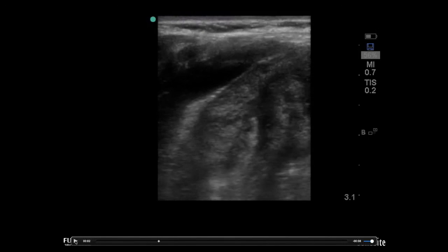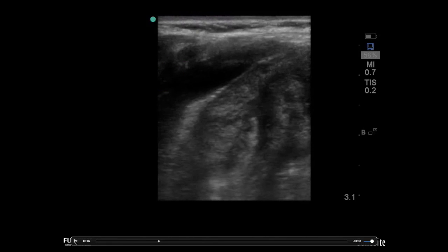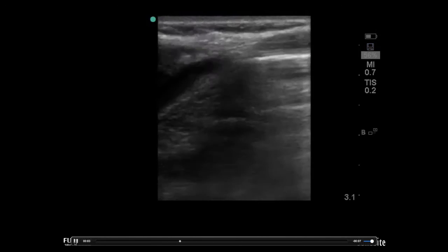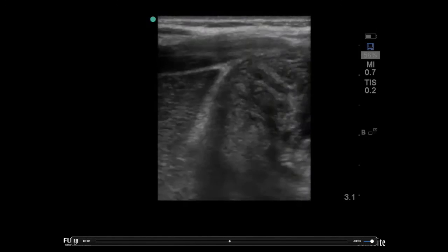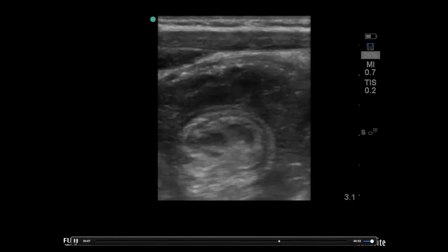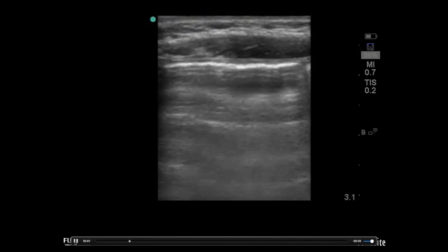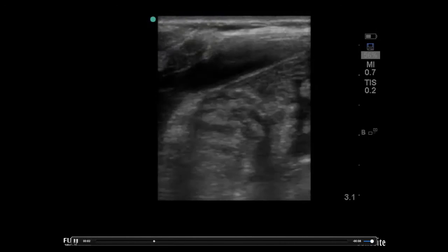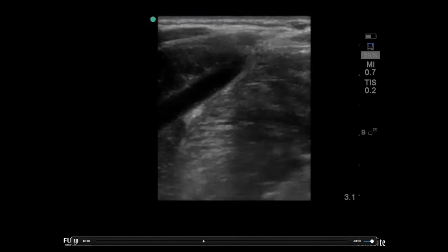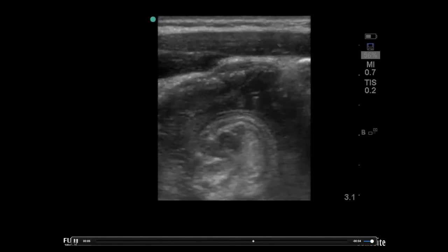Freeze this image here — you can identify the gallbladder right here, highlighting the location, which is of particular importance. Let this video run one more time: see the air, start to see a circular appearance — that cinnamon roll — and then bang, right there. That's the target. It also looks to me like a big sushi roll. That's the ileocolic intussusception — that is what we're looking for.